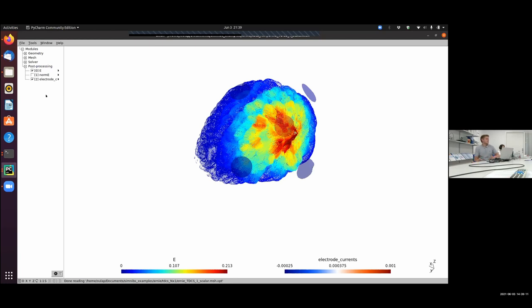Then there's from Sara Romanello, you can do cerebellar stimulation, yes. You then have to manually define the coordinate of the cerebellar stimulation and the direction inside the cerebellum, and it will do it. I guess for cerebellar stimulation, you might consider changing your EEG cap a bit to add more electrodes, maybe also further down. This is something which you have to do one time for the MNI template, and we can also give you hints on where this has to be changed, just to ensure that the optimization also figures out a proper way of stimulating the cerebellum, simply because when your electrode coverage is too limited, it will give you the best possible result for this electrode montage.